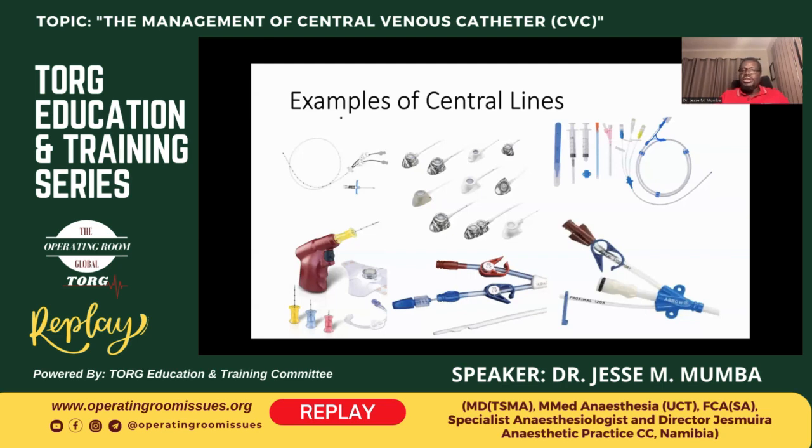So in places where you need rapid resuscitation with fluids, this is probably your go-to. The sheaths can also be used for interventions. When we're doing interventional cardiology, the cardiologist will place sheaths, and through there they'll place their interventional wires.